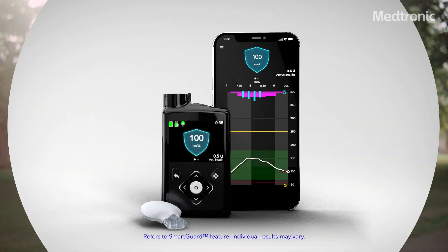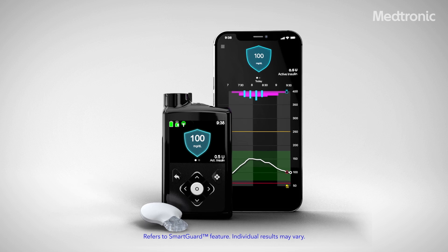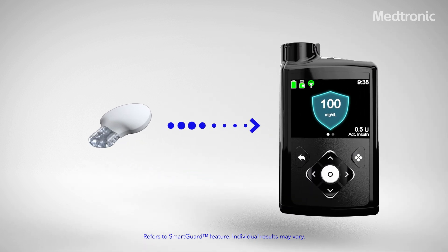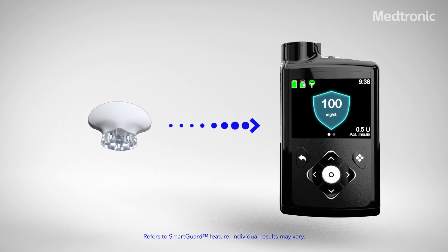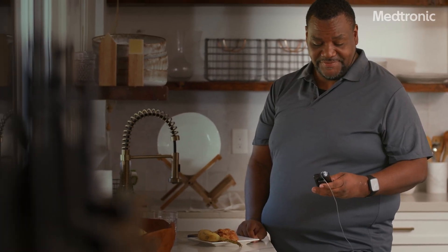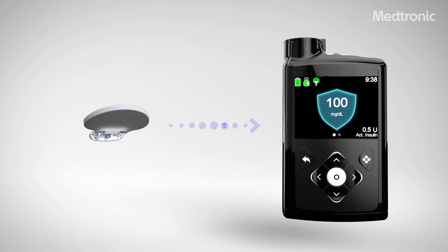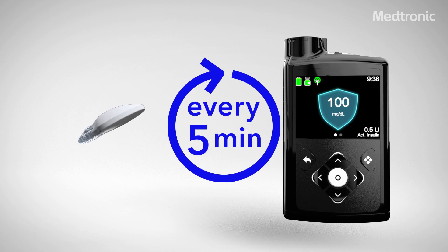SmartGuard technology is the automated insulin feature available with the system. The Guardian 4 sensor measures your sugar levels and sends that information to the pump. The pump uses that information to anticipate your glucose trend and automatically adjusts insulin delivery and corrects highs up to every five minutes.